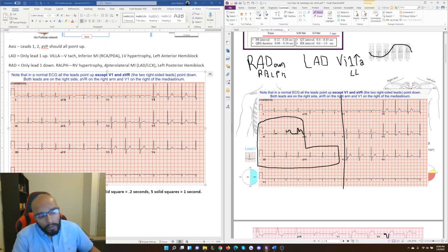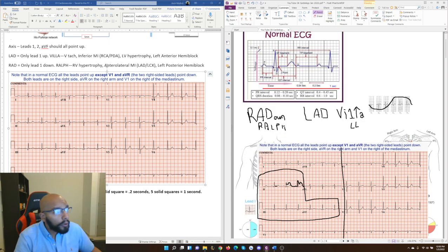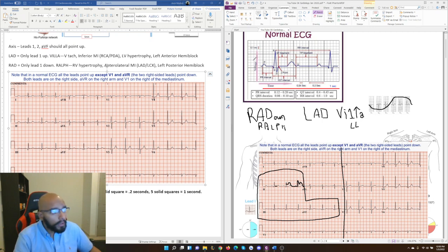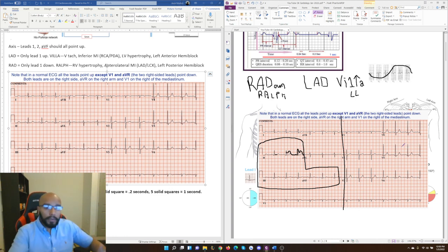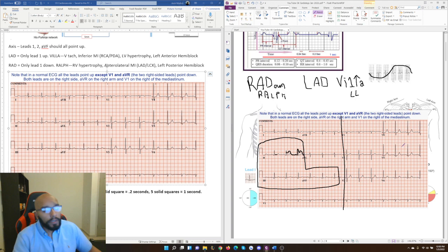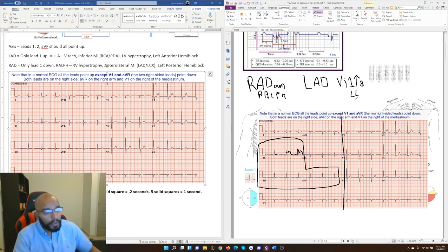V4 — or it can vary between V3, V4, and V5 depending on the patient — is generally the one with the highest peak, representing the highest voltage at that point. Remember, the x-axis is time and the y-axis is voltage. The highest peak is usually V4 because that's where the strongest electricity reaches the heart and full depolarization occurs. If any lead's R-wave isn't working properly, that lead is looking toward the side of the heart that isn't working well.